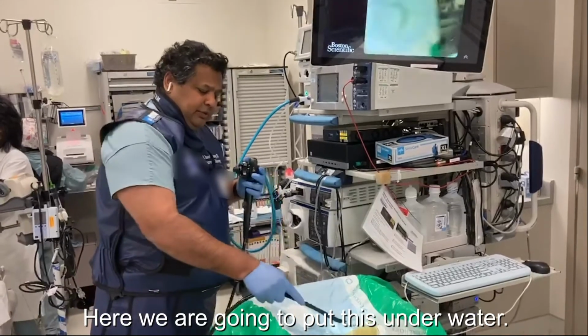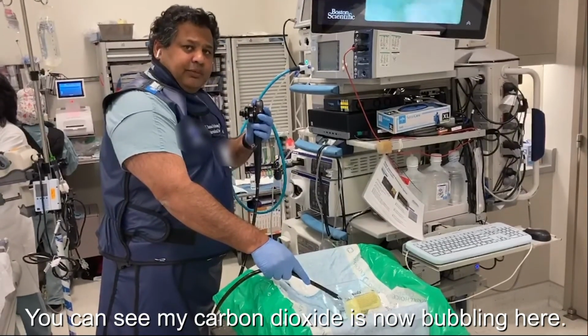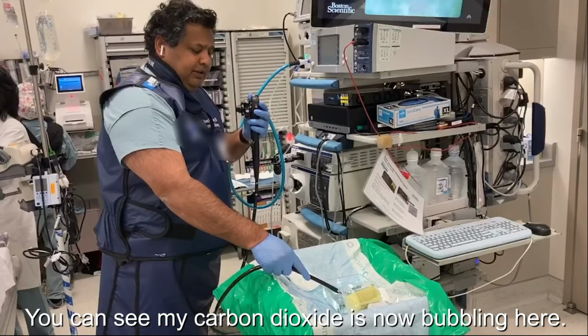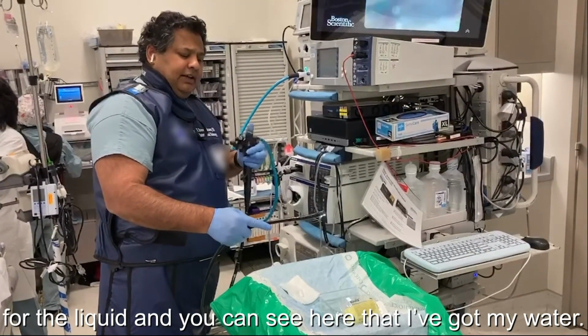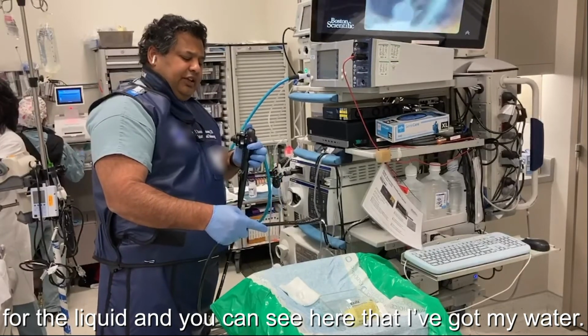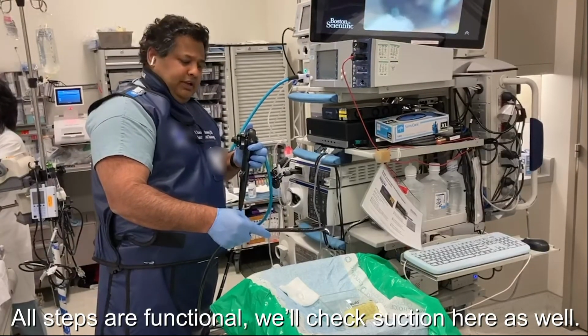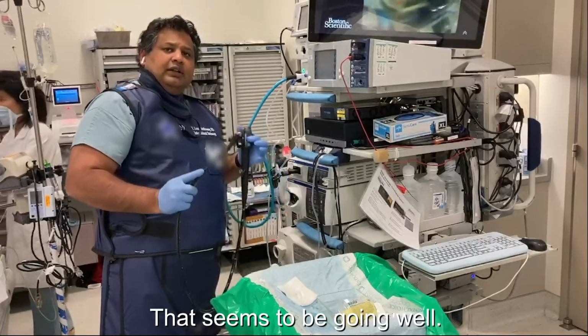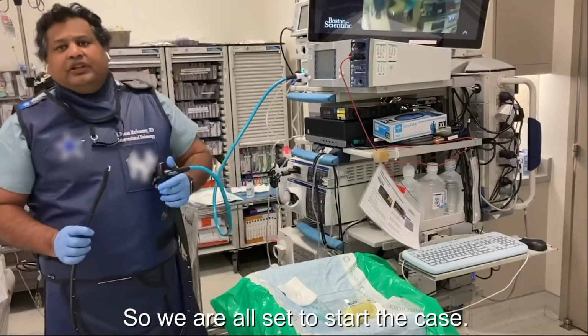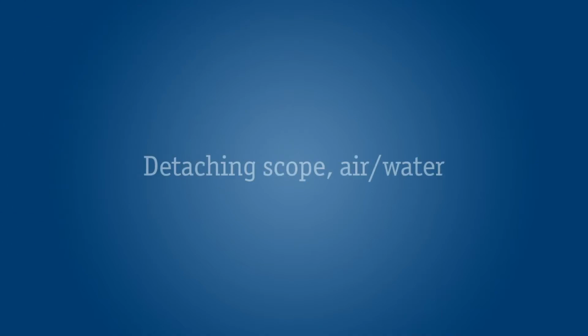So here we're going to put this underwater, and you can see that my carbon dioxide is now bubbling here. And then I will go ahead and I'll press on my button for the liquid, and you can see here that I've got my water. Okay, so all steps are functional. We'll check suction here as well. That seems to be going well, so we're all set to start the case.